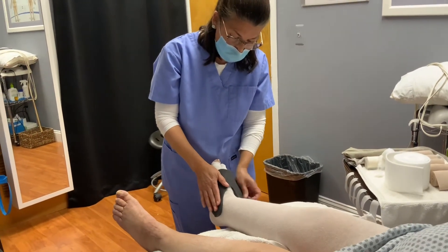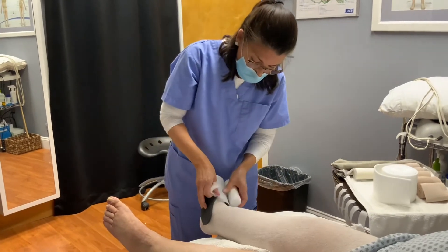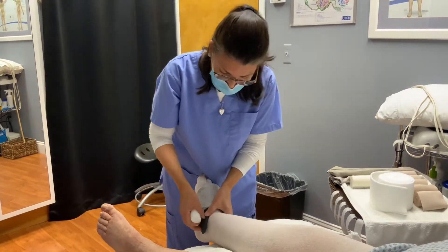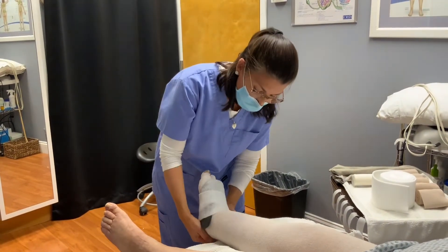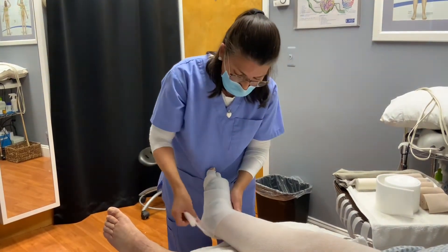We are going to be using this foam here — it's called a gray foam. It's a quarter inch, and we're going to come around at the ankles where she also gets a lot of swelling. We're going to contain it with a layer of the cotton just to hold it in place.